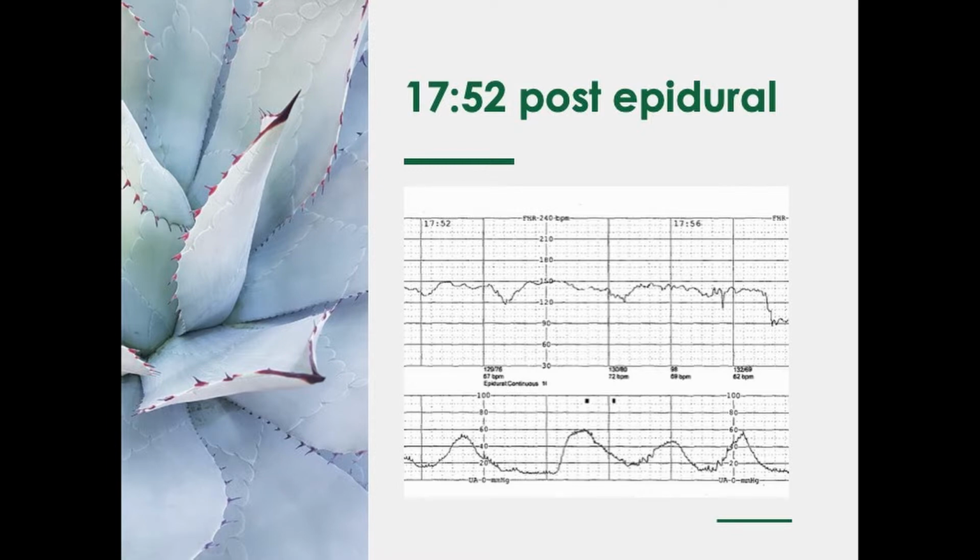This, however, doesn't have a sharp drop-off, right? It has a gradual decline to a nadir, or the lowest part. Nadir means the lowest part of that fetal heart rate deceleration, that occurs after the peak of the contraction. So that isn't a variable, right? It didn't meet those definitions. So what is this? Late. Good.